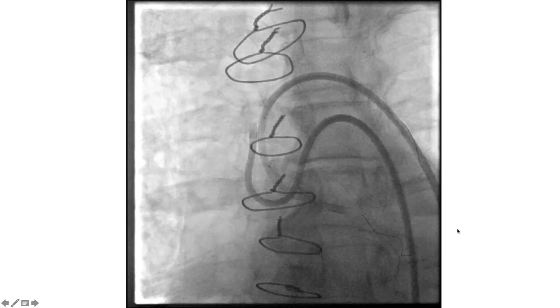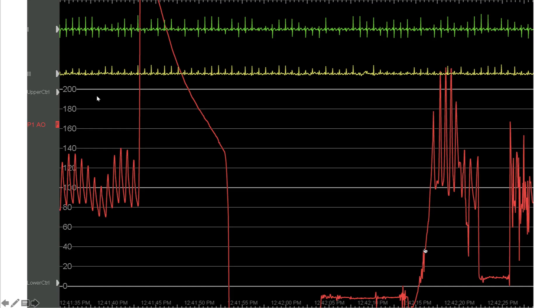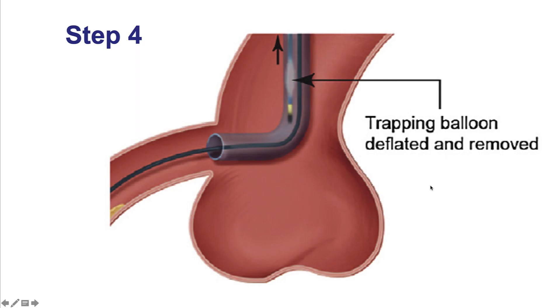Once the balloon is inflated, we should see disappearance of the guide pressure. If the guide pressure does not change, that should be a source of alarm — it means we are not providing effective trapping. When trapping, it is important to notify the control room and the person monitoring pressure that we are trapping, so it is normal to lose the aortic pressure for the duration of trapping. The trapping technique also reduces the radiation dose.